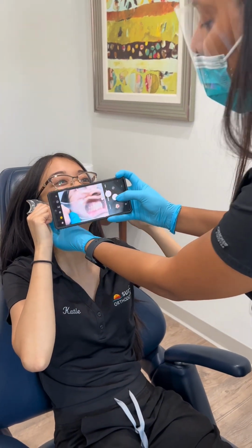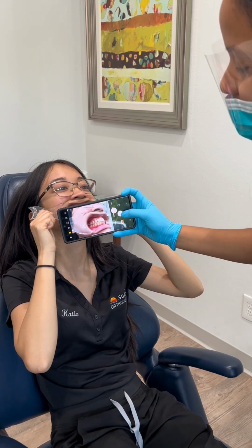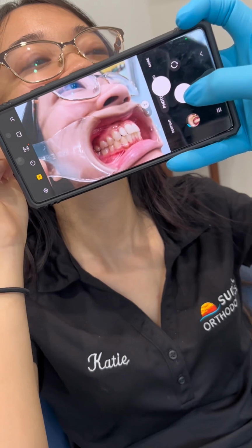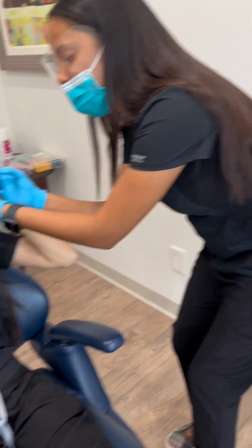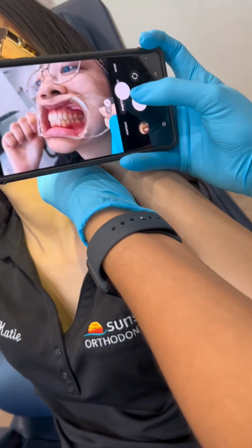I typically tilt it just a tad bit up, just like this. That gets a good picture. You can get in here and see that. See, just like that. That gets a good picture right there. All right, and then we're going to do the same thing on this side. We're going to get this picture real good. Right here. Perfect. Now we're going to do the upper and lower occlusal shots.